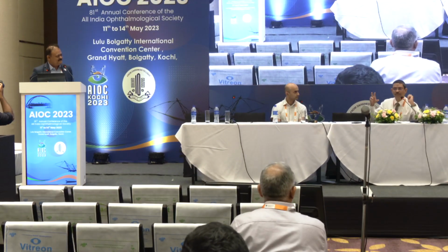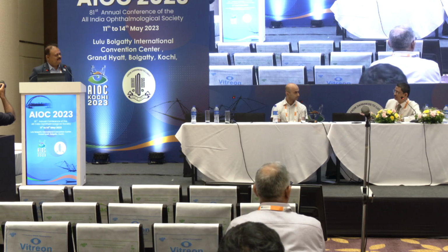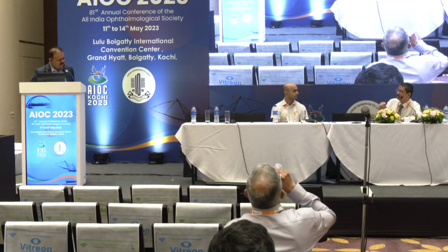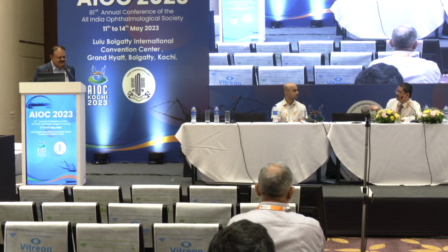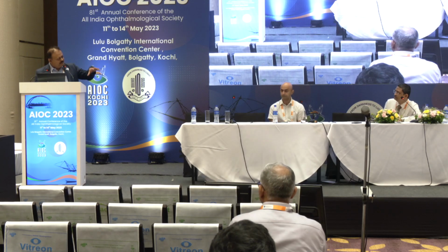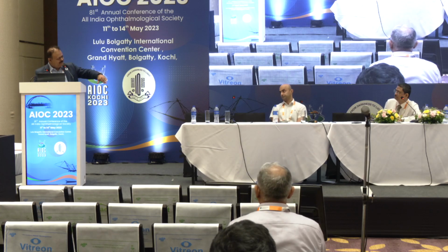True. But again, the mechanism of a primary hole surgery and a failed hole surgery where you are putting an ILM free flap there, these are two different things. So in case of a recurrent or failed macular hole, it is a good idea to gently massage the margin and the edges, make it a little closer, smaller. I think various techniques are described. Some surgeons prefer to give a PFCL and then mechanically scrape the edges under the PFCL.